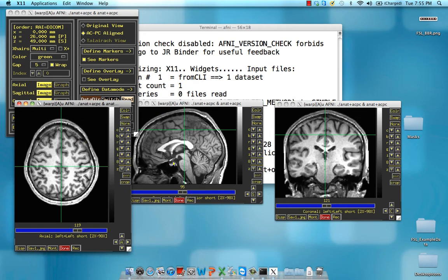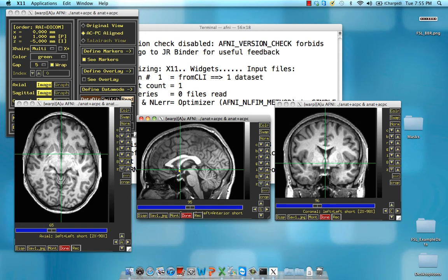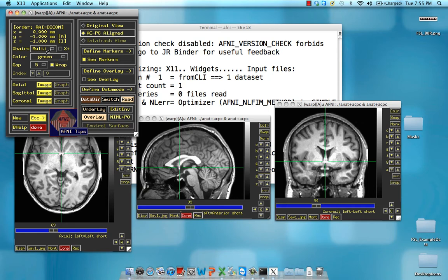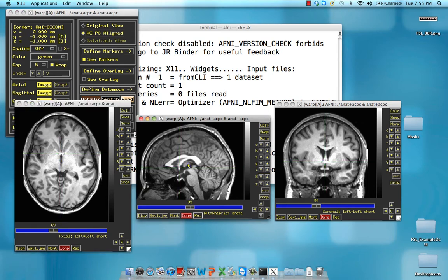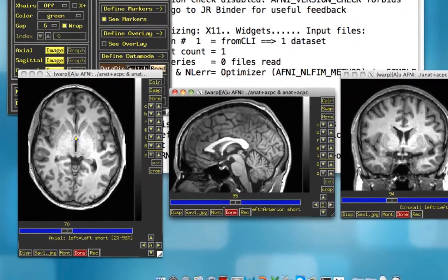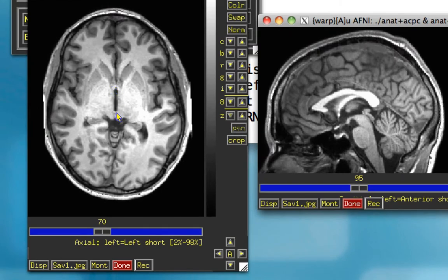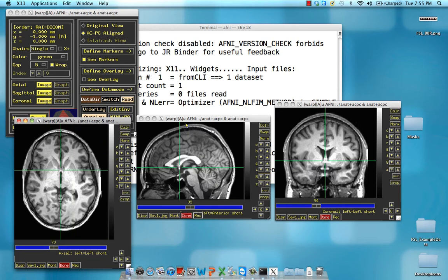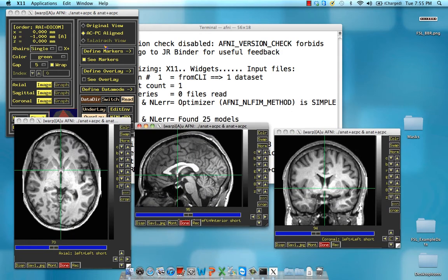You'll notice your data sets look a little different. Specifically, the anterior and posterior commissures are now aligned evenly — the very top of the anterior commissure and the base of the posterior commissure will be exactly in alignment, or pretty close. If you turn the crosshairs off just to get a better view, you can see the anterior commissure starts to go out of focus and the posterior commissure starts to go into focus. That's the ACPC, and now we want to go one step further and warp it to Talairach space.